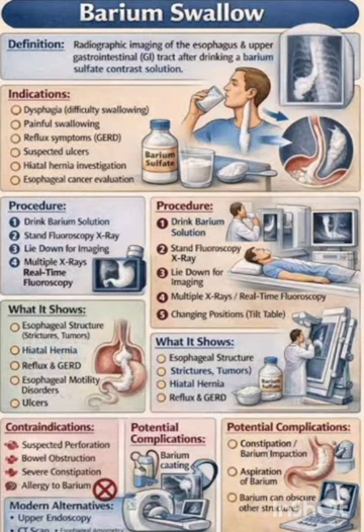The barium swallow examination may be performed by two methods. First, a single contrast study. Next one, double contrast study. Single contrast study is performed for the evaluation of motility disorders and luminal abnormalities. Double contrast study is performed for evaluation of the mucosal details of the esophageal wall.